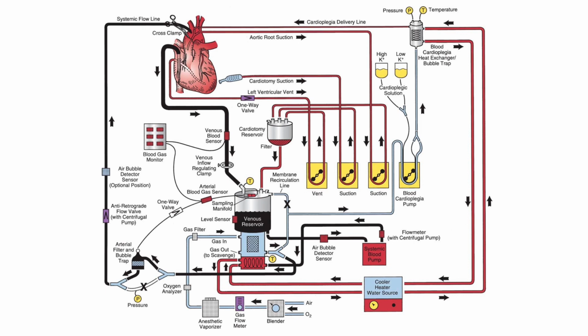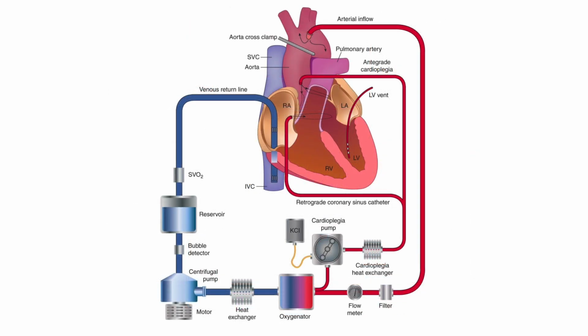Now is when someone will usually put up a picture like this. This diagram is taken from Glenn Gravlee's excellent text, Cardiopulmonary Bypass and Mechanical Support. This tangle of lines, arrows, and captions is certainly complete, but when I introduce this topic, I like to take a more simplistic approach. This figure, which is also taken from Dr. Gravlee's text, presents cardiopulmonary bypass in a far simpler schematic.